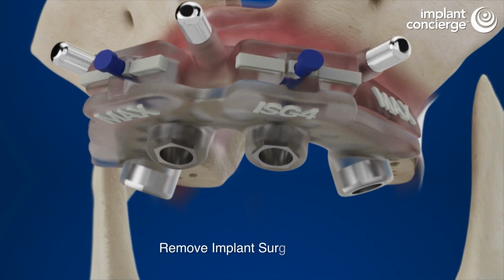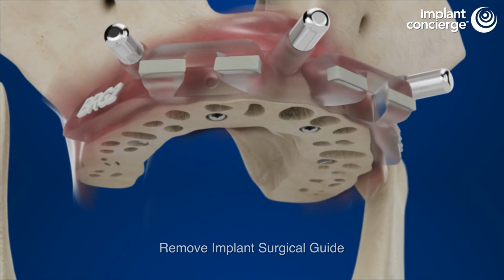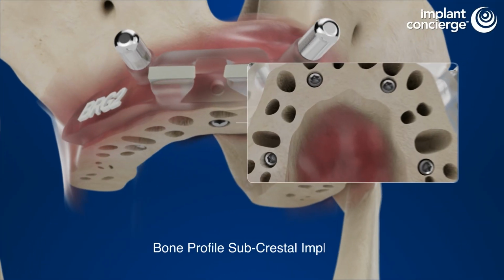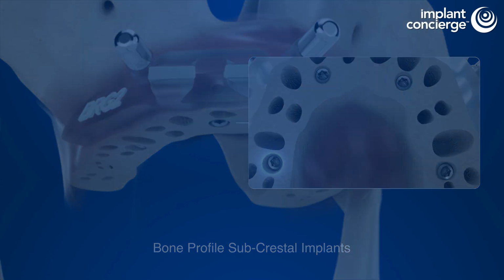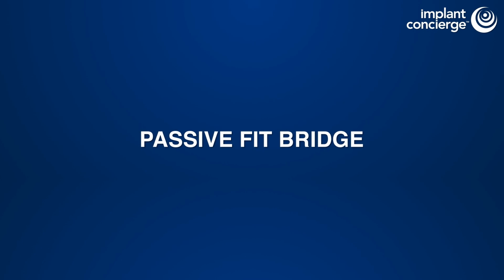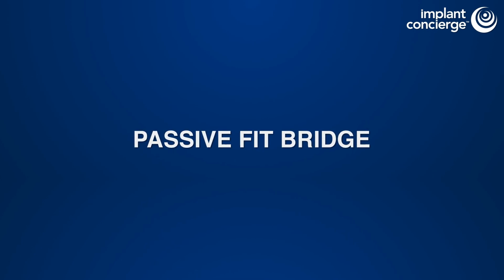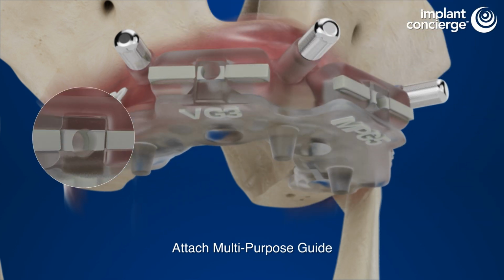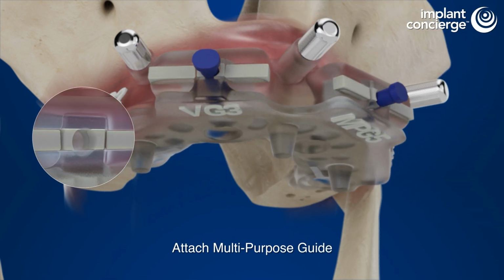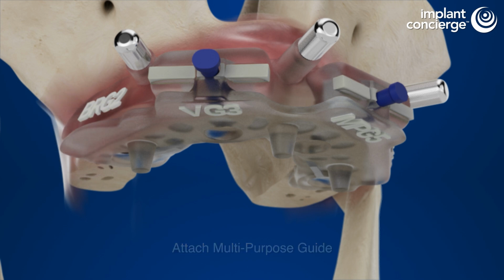After placing the implants, remove the blue pins and the implant surgical guide. If the implant is placed subcrestally, carefully remove the bone around the implant shoulder to allow the abutment to seat fully. If you added a guided prosthetic for immediate delivery, follow these steps to deliver the passive fit bridge. Attach the multi-purpose guide to the bone reduction guide, securing with the blue pins and verifying indicator lines alignment.